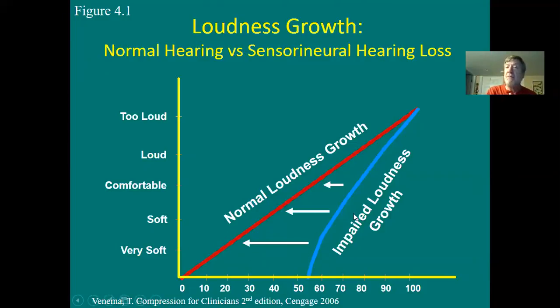We're looking at the light blue line. Whereas 90 to 100 still sounds too loud. And so hearing aids have to amplify the soft sounds by a lot and loud inputs by little or nothing at all. Now, we covered that in compression class 240, right? Hearing aids today all address compression, and all fitting methods today address compression, but they didn't used to.